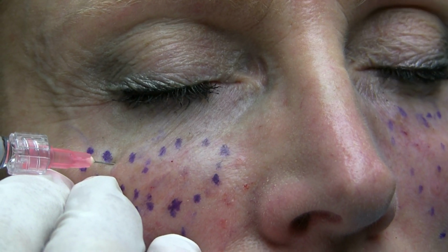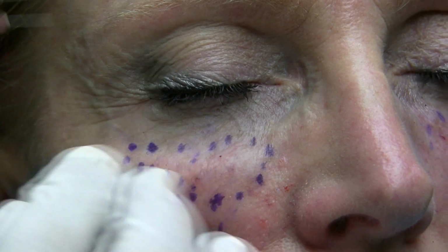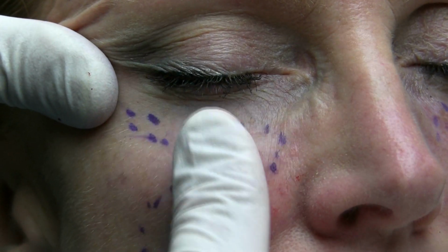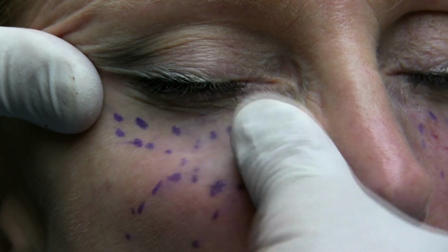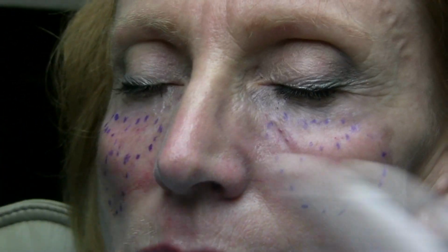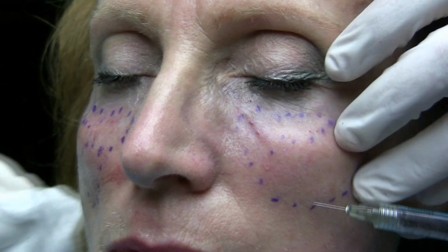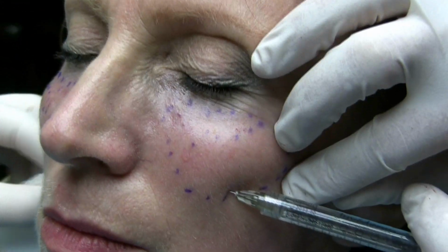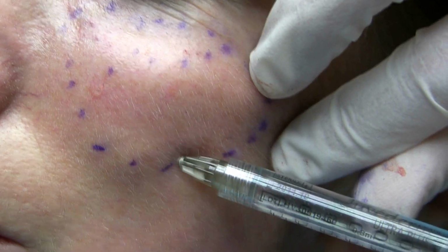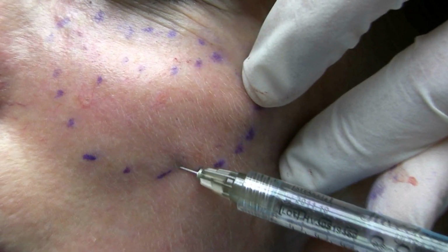I tell these patients to expect bruising. And then what we're going to do is we're going to massage. We're going to massage these areas out. And this is two syringes here. We've got a syringe on each side for the tear trough and cheeks. And now we're going to take a syringe. This happens to be Ultra Plus, so we're being very ecumenical today. We're using everybody's products. And we're just going to go back and add.